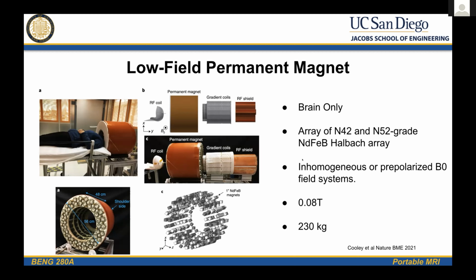So I think there are many different methods. For this specific one, the permanent magnet with the Halbach array does have a pre-polarized field here. And I also believe, if I remember right, they also use something else there to create the polarized field here. Okay, great. It sounds like they probably have an additional coil there where they pulse the field intermittently to do what's called pre-polarization, and then they turn it off.